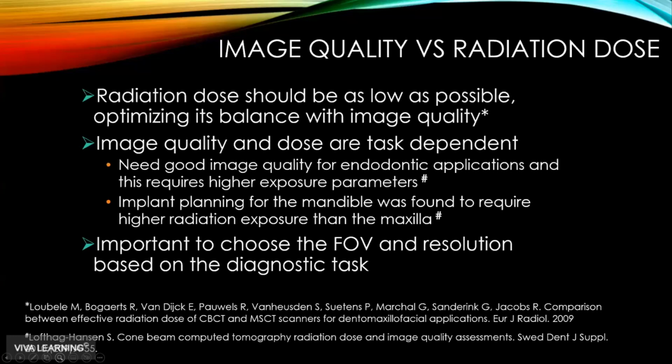So that brings us to the point of image quality versus radiation dose. Clearly it makes sense that the radiation dose should be as low as possible, optimizing its balance with image quality. And this comes from this article below, this Lubell article. But the big thing we need to remember is that image quality and dose are task dependent.